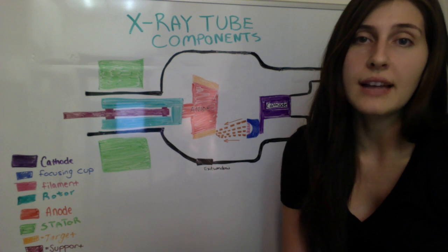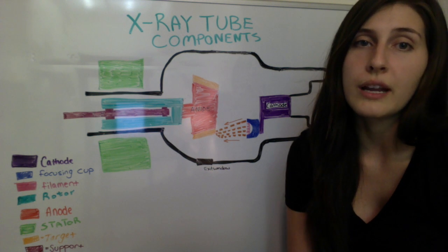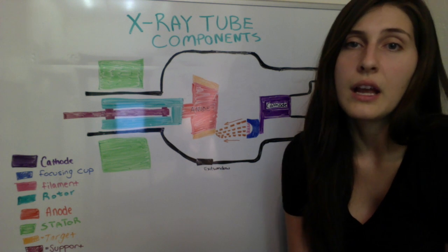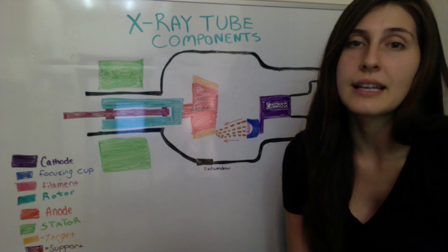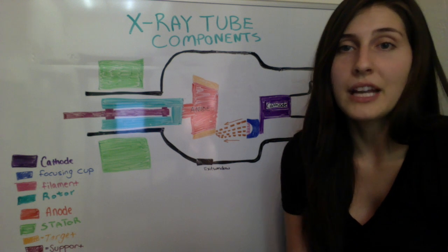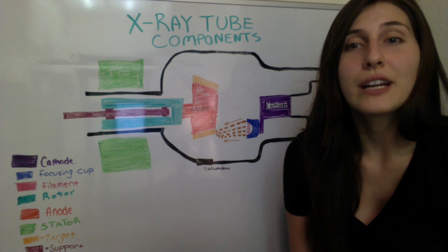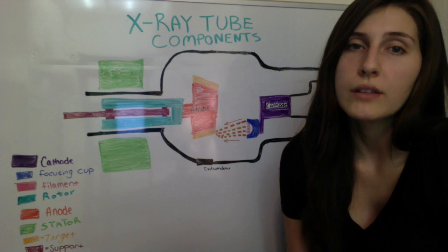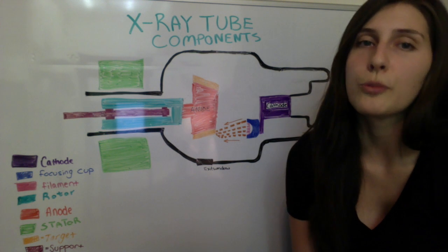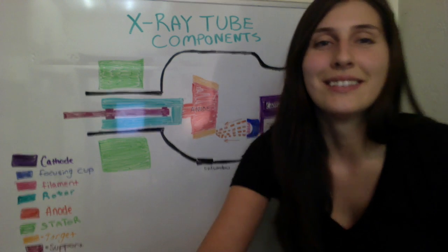The X-ray tubes are designed to have specific focal spot sizes. A small focal spot can produce less blurring and better visibility of detail, and a large focal spot will have a greater heat dissipating capacity. Focal spot size must be considered for specific applications. Small focal spots are used for small and thin body regions, and the amount of radiation needed is relatively low, whereas large focal spots are ideal for imaging the lumbar spine. Most X-ray tubes have two focal spot sizes, small and large, which can be chosen by the operator.